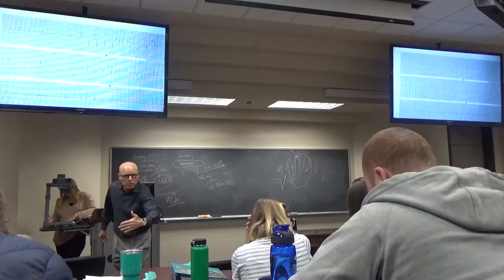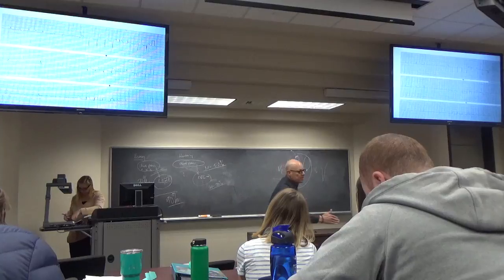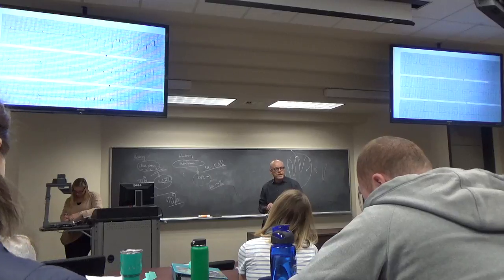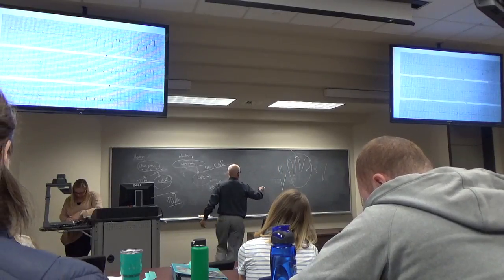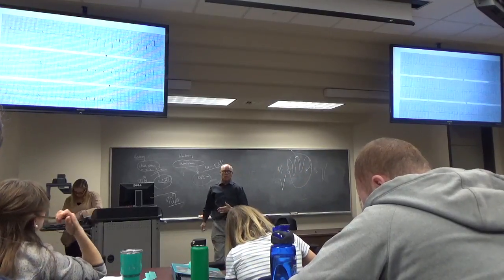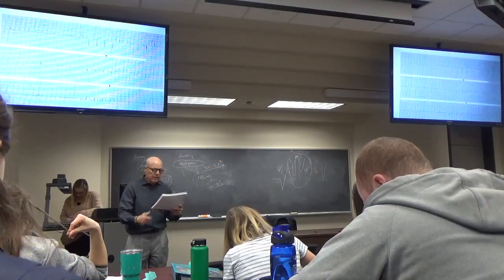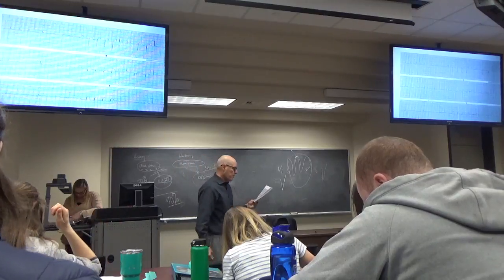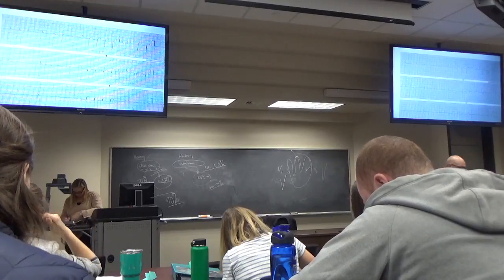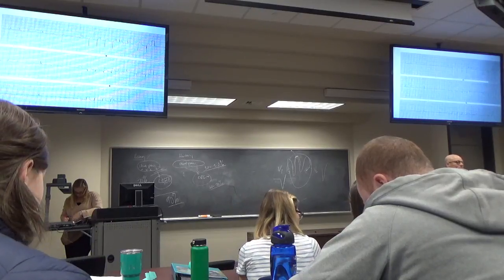Depolarization wave going in, repolarization wave coming out, as Jacob described it. Depolarization wave is normal, repolarization wave is normal. When the depolarization wave is abnormal, as it is here, repolarization wave is going to be abnormal. And what we're calling elevated convex ST segments in V1, V2, V3, and V4 are just abnormal repolarization waves from an abnormal pre-excitation center.